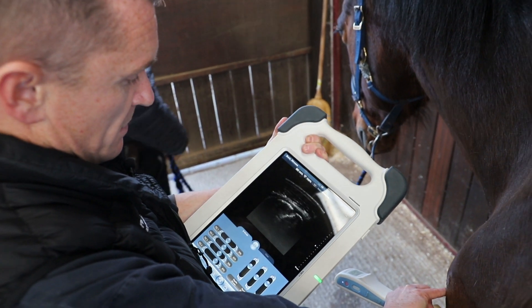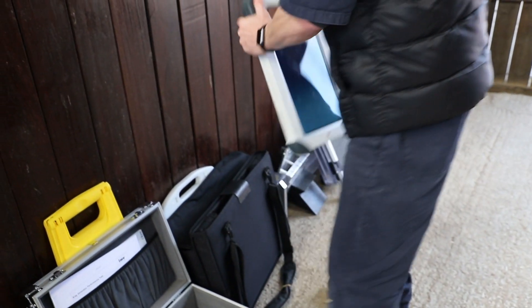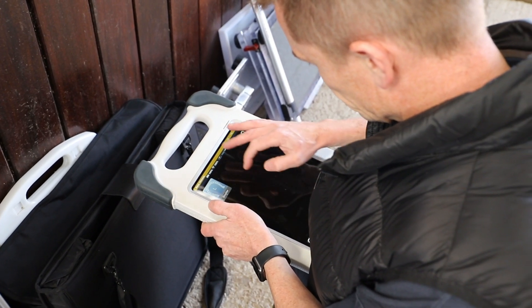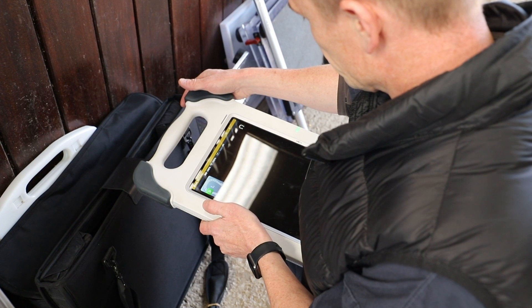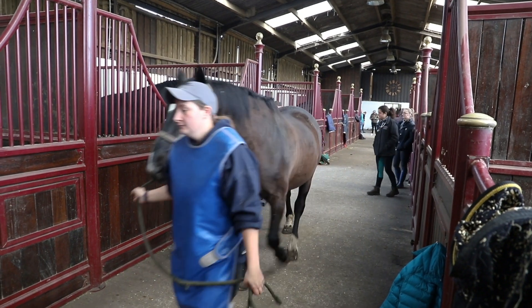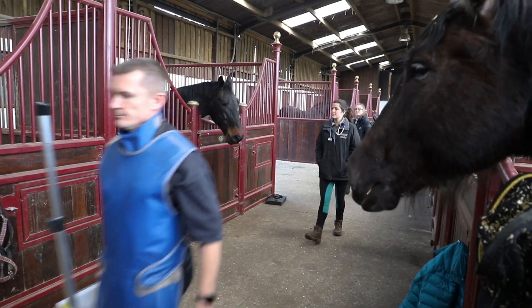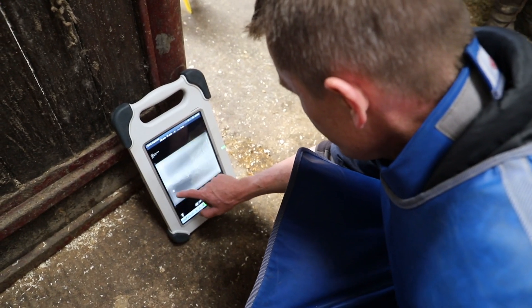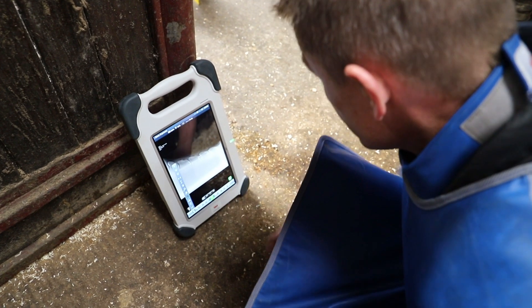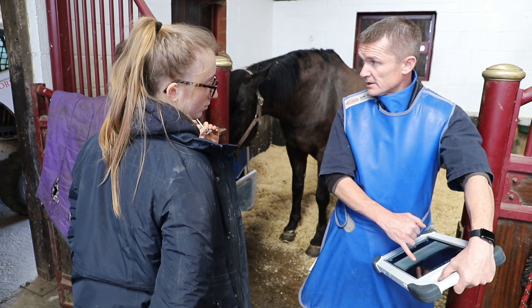We've got the new Slate Hub with the SonoSlate, which has been absolutely fantastic. On the original system we used to take images out in the field with a portable X-ray head — the quality was okay but it wasn't fully diagnostic, so we had to come back to the practice. Now with the new Slate Hub we don't have to do that. The image quality and resolution on the screen is absolutely ideal, so we can get diagnoses and be a lot more concrete with clients and patients on the day.